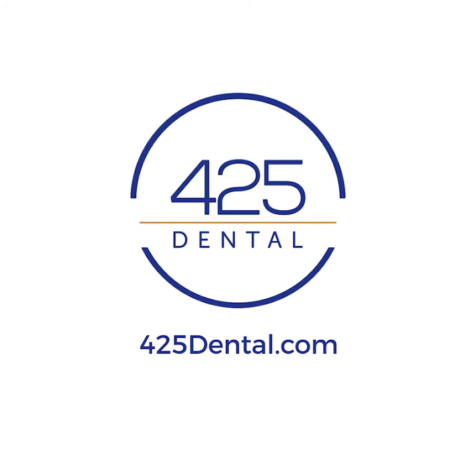When putting your aligners on, they are 95% seated on your teeth. You will need to use your chewy we provide to help push the aligner the remaining 5% of the way. You will bite and squeeze the chewy between your teeth, going from the right to the left all the way around. Please make sure to do this anytime you remove or replace your aligners.